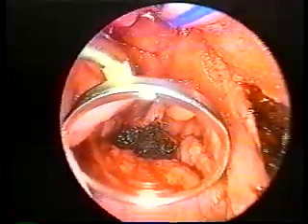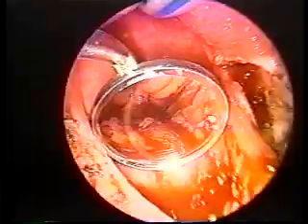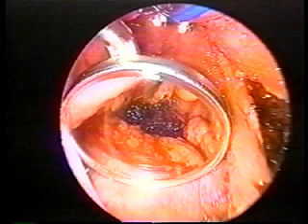Blood loss was comparable with both techniques. There were no postoperative complications in either group. Besides the obvious advantage of speed, we feel that the most important advantage of the microresector technique is precision. The microresector affords a degree of control over tissue removal that cannot be matched by curettes, and therefore the risk of inadvertent tissue removal is lessened.